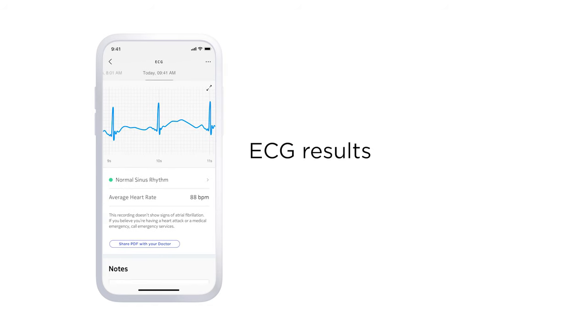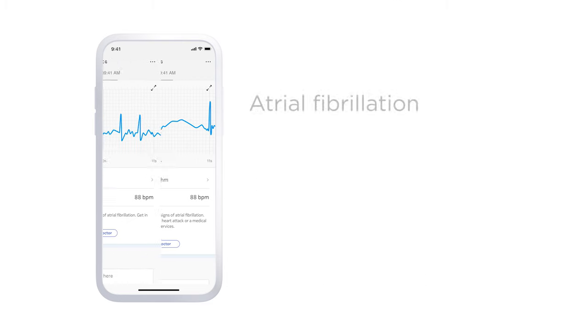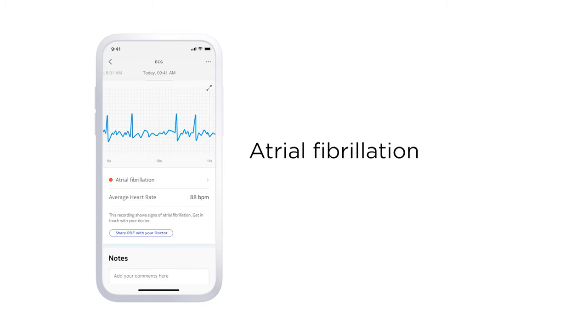Concerning the ECG, here are the results you may see. Normal sinus rhythm means your heart is beating in a uniform pattern. Atrial fibrillation occurs when the two upper chambers of the heart move chaotically instead of pumping regularly. This creates a very jumpy baseline on the ECG graph.